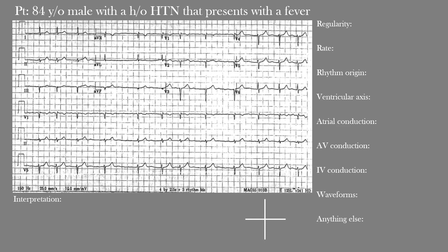One of the main things we do is use the R waves, or whatever the prominent wave is in the QRS complex, to look at regularity. Regularity means: is the distance between these R-to-R intervals the same throughout? You can see it's clearly different from one interval to the next — constantly changing throughout the EKG. Using calipers or paper to measure confirms it's always changing. So we call this an irregularly irregular rhythm — no regularity whatsoever.